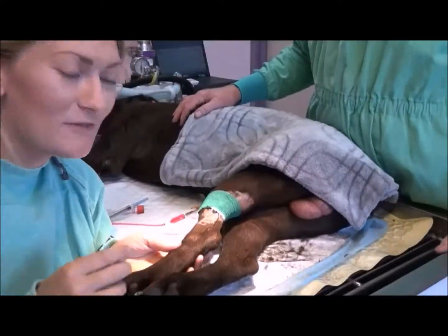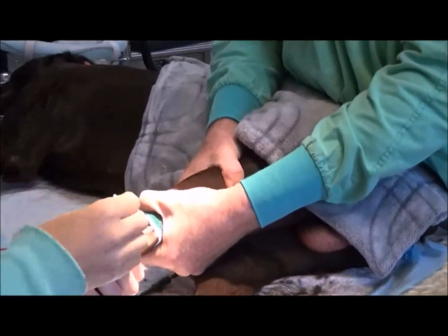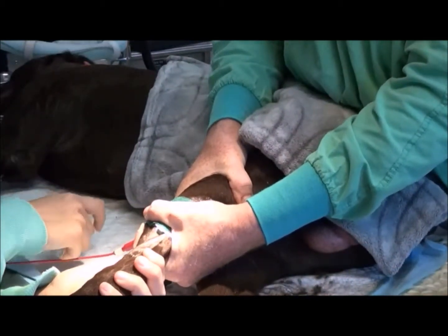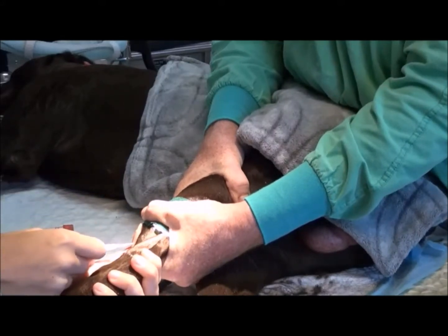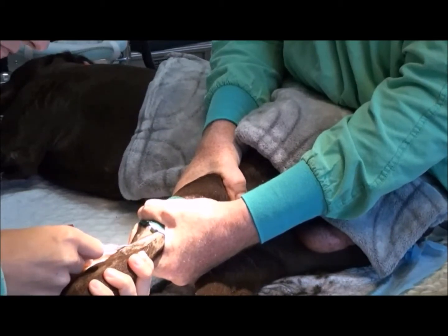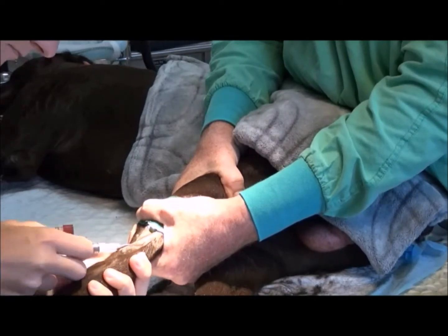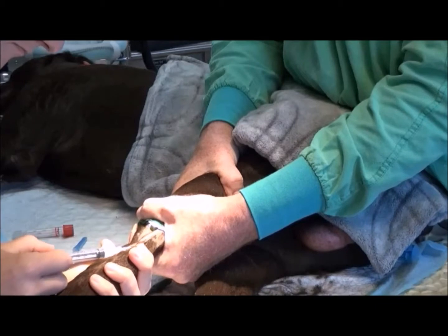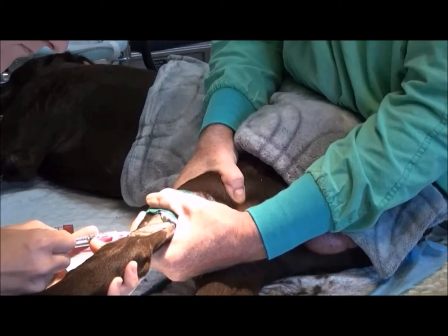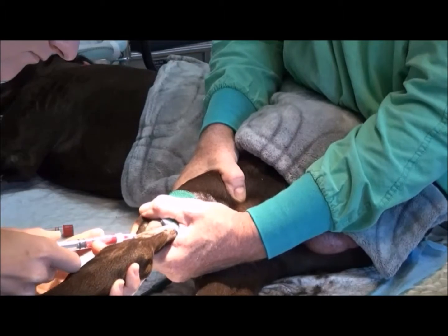I'll now collect a blood sample from the saphenous vein of a canine patient. Okay, that looks like plenty.